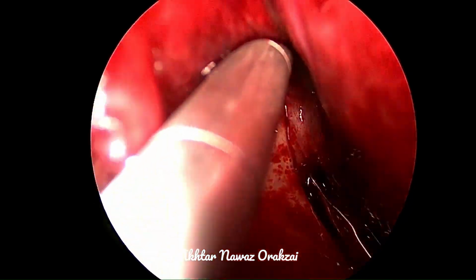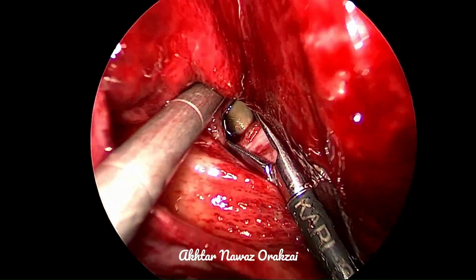is the removal of the stone. Laparoscopically, it was not an easy thing.